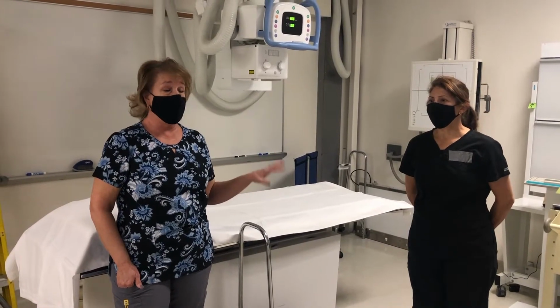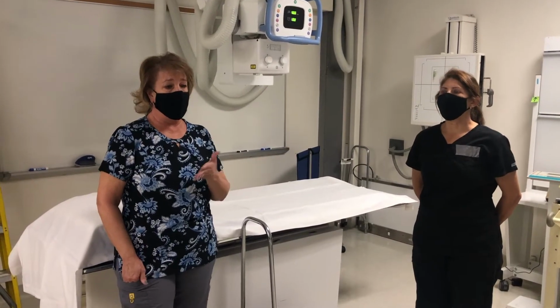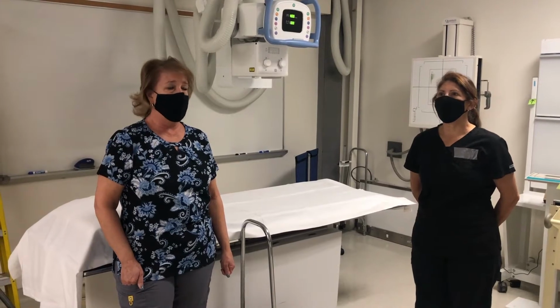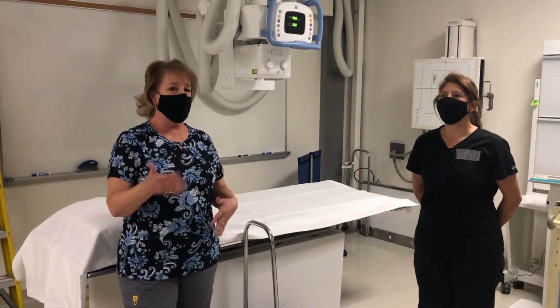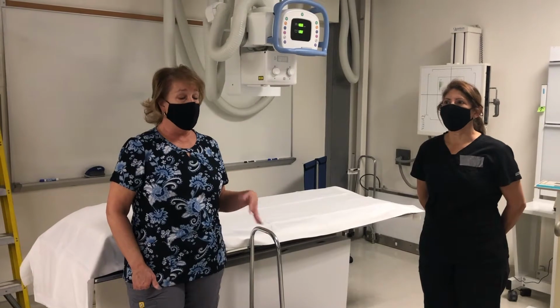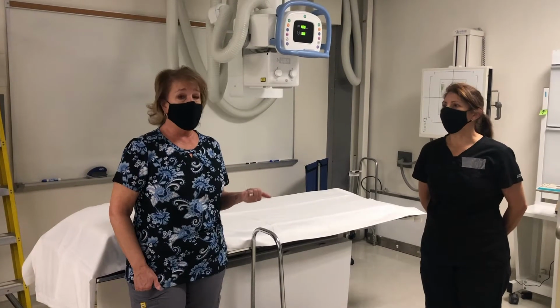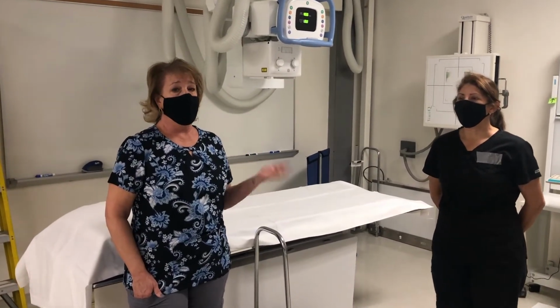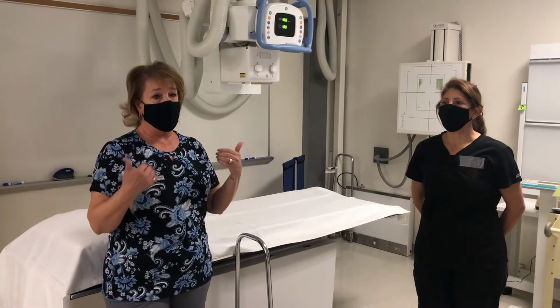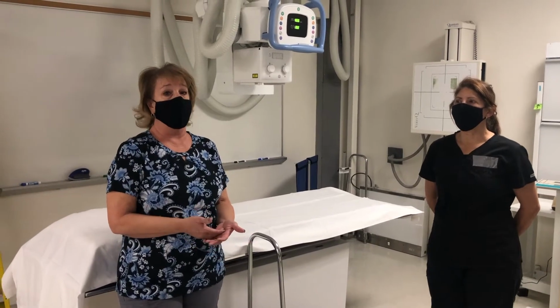It involves the patient doing some type of prep to get ready for this, usually just nothing by mouth prior to midnight before. And no chewing gum, nothing that could cause gastric juices to start flowing, because we ideally want the bowel to be as free of material as possible so that it doesn't obscure the kidneys. And then just prior to bringing the patient into the room, I would have them go into the restroom and void so that their bladder is empty, because once the contrast is processed by the kidneys and enters the bladder, if the bladder is already full of urine, it could dilute the contrast.